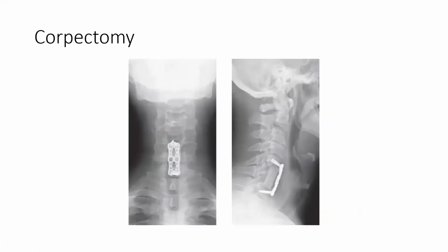you can see this plate here. If your plate is high riding, it'll definitely cause accelerated damage to the disc above. Whether it's because you've got a very stiff modulus of elasticity here and it suddenly changes, or by putting a plate in your damaged disc, not always sure, but often with the high riding plate, you'll see that superadjacent degeneration, and that's a problem. Some of these patients are quadriplegics and their head is their functional limb, and you're obviously taking some motion away by fixing them. You don't want them to start getting accelerated degeneration at the adjacent level. So be quite careful and put the plates so as not to encroach on the disc above or below.